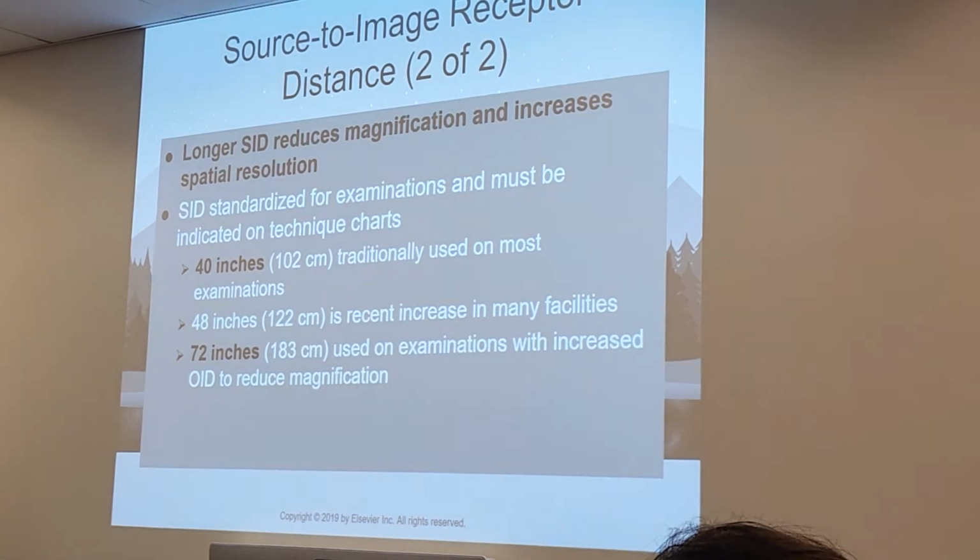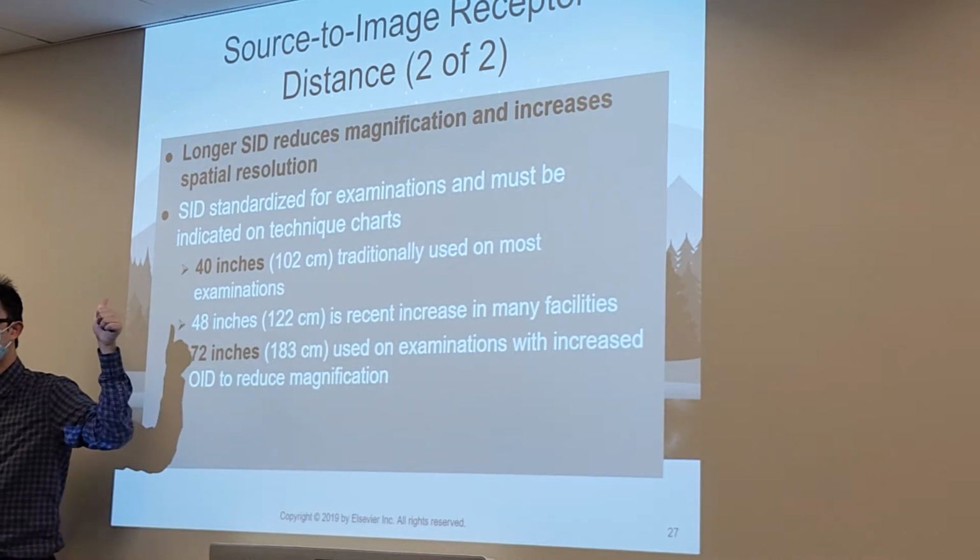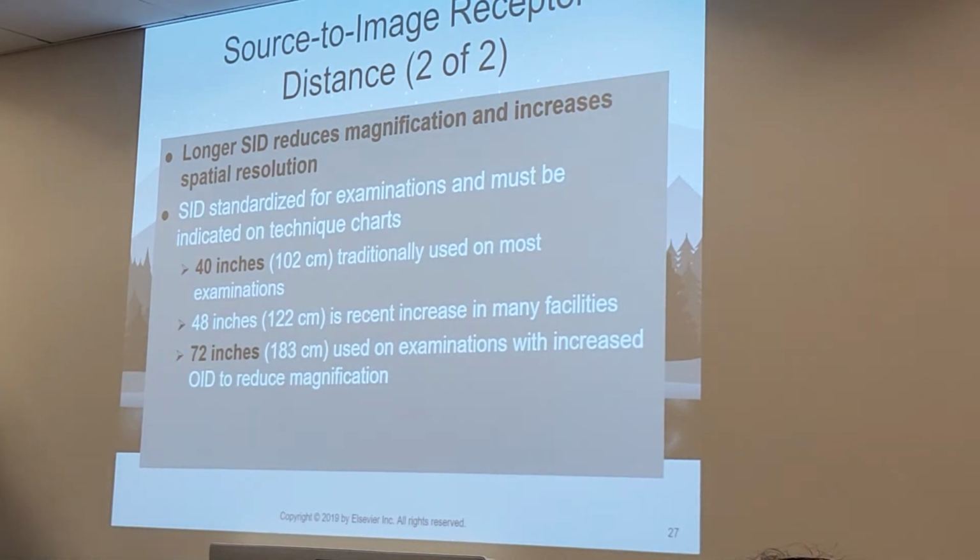So just to clarify, if you decrease the distance, you're increasing the patient dose. If you decrease distance, you increase patient dose, yes. Right, so like I said earlier, longer SID, bigger distance, reduces magnification, increases spatial resolution, so your image looks better.